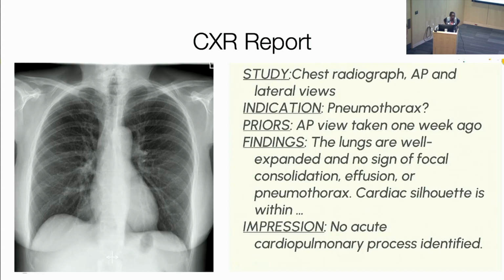Thank you. So the question is the indication field, the answer is the impression field, and the evidence I use to get to the answer in the impression field is the findings. Ideally, but rarely, and I'll tell you why. In an ideal state, the indication should be the question that you want answered.